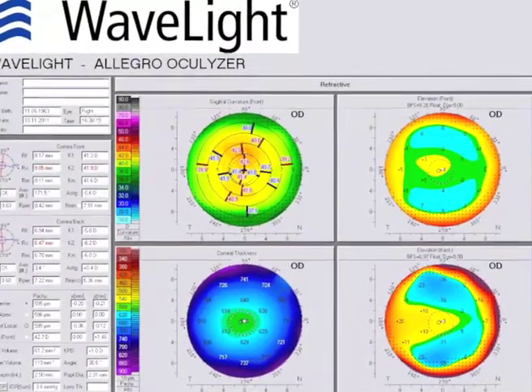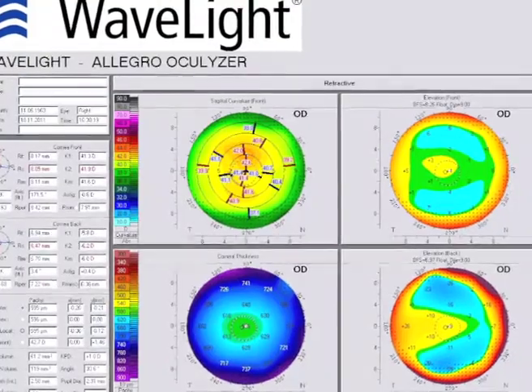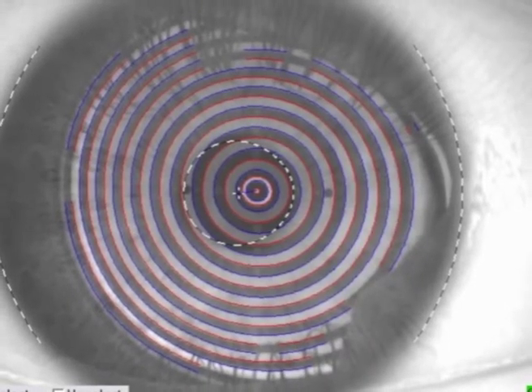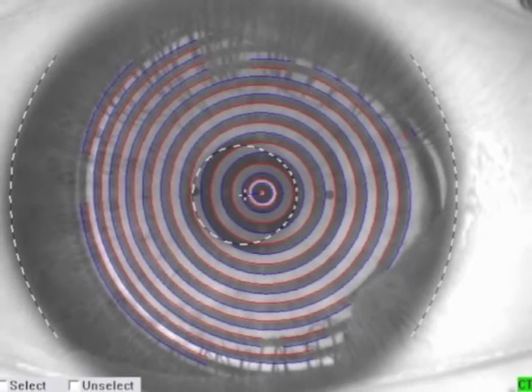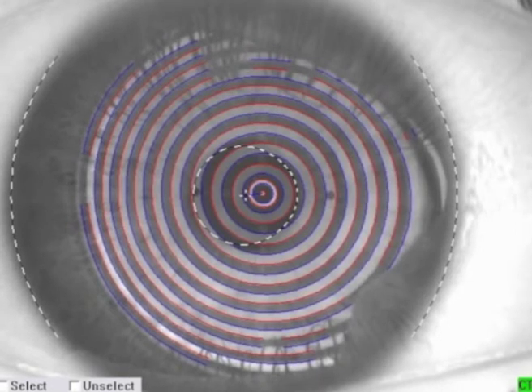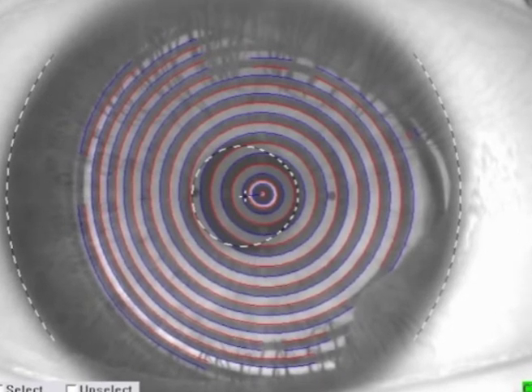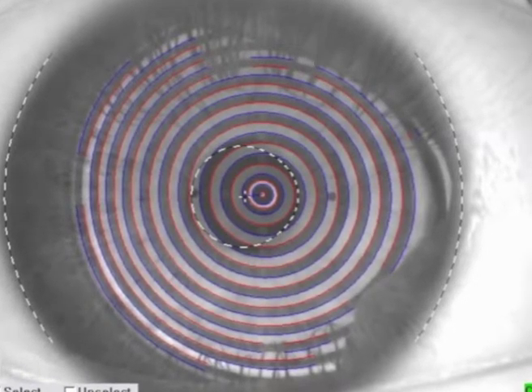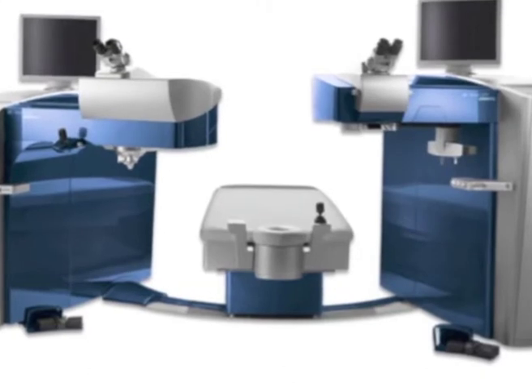This is an example of a high hyperope on the Pentacam — a normal cornea — but if you study the Placido Disc images you can see that the pupillary aperture is eccentric to the visual axis. Clearly the visual axis is skewed nasally on this right eye.